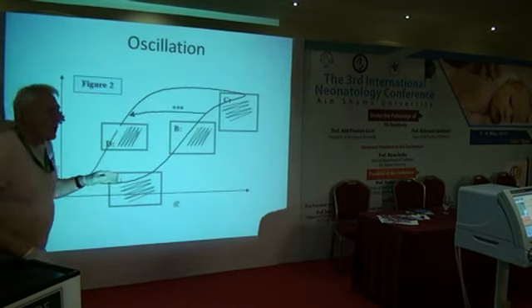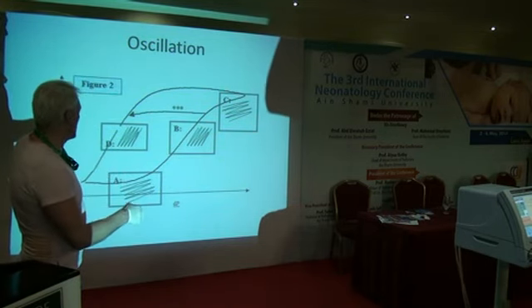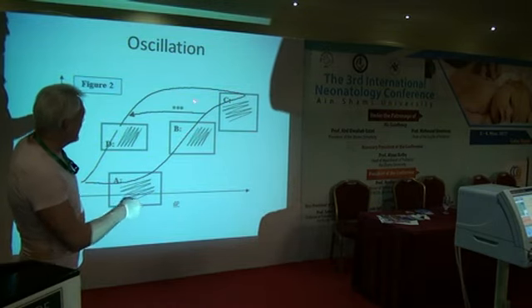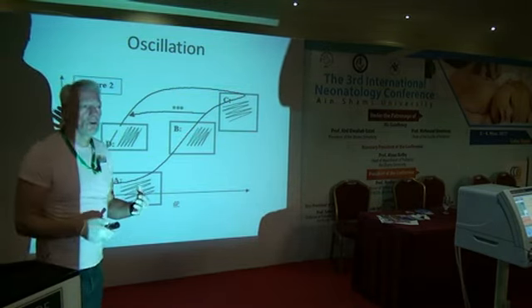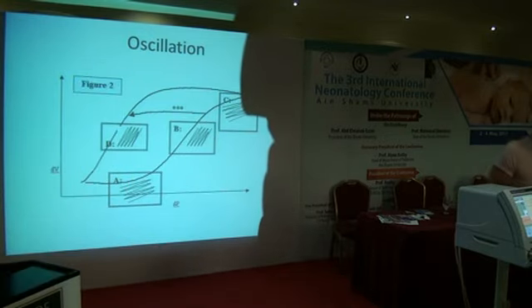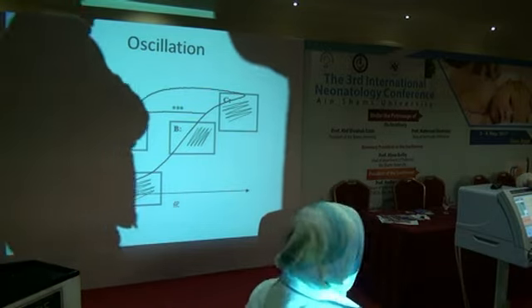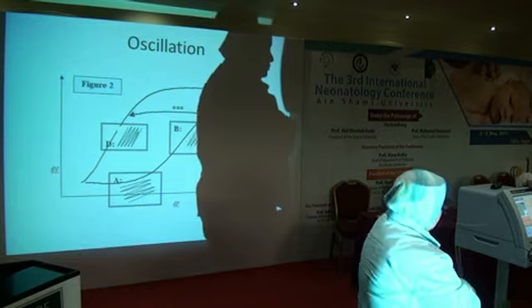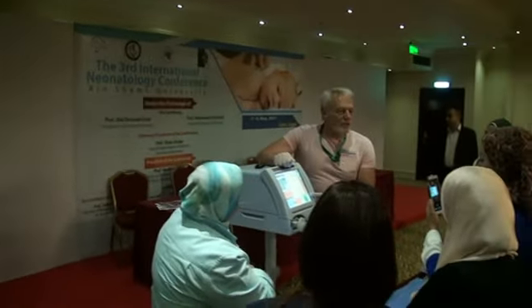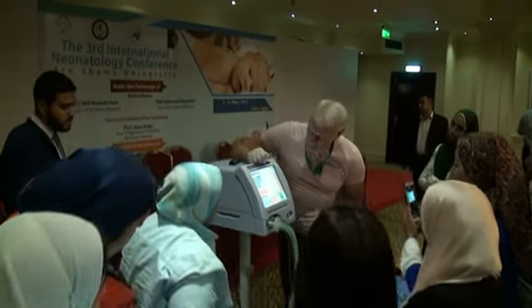And you know about going up on the pressure volume curve with conventional ventilation. Actually, it's exactly what we're going to do, the same thing with oscillation as to how we ventilate our babies, which I'm going to demonstrate to you now. So we've decided we're going to have a mean airway pressure of 14, and let's go for a delta P of 30, shall we? Something like that. And we've decided a frequency of 10.